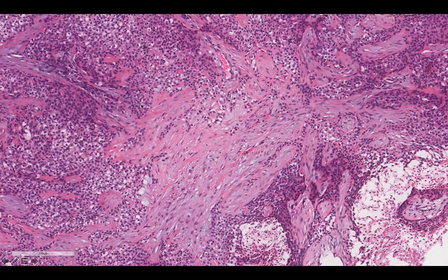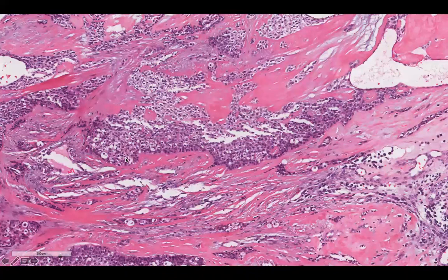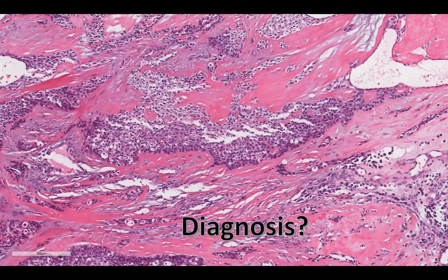In some areas, a little bit more eosinophilic cytoplasm, but we don't really get the sense that this is biphasic per se. It's probably the same tumor cell type. It's just they have different morphologies depending on the field we're looking at. Again, another field where we just have sheets of these tumor cells with somewhat cleared out cytoplasm, and then this really dense sclerotic stroma.